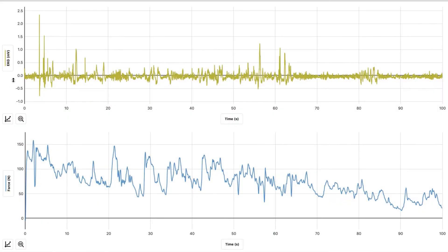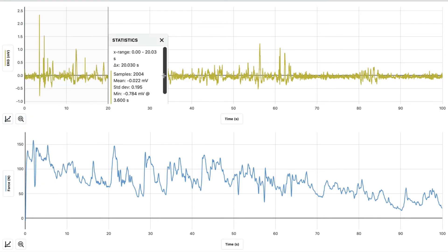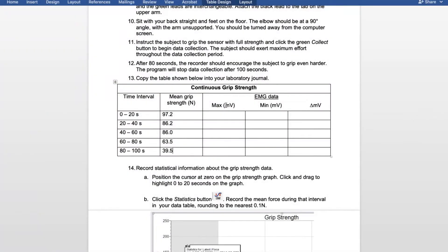Now we're going to take a look at the EMG in millivolts. Select and highlight from 0 to 20 seconds. Hit the graph, view statistics, and look at the minimum and maximum mV values. For 0 through 20, the maximum was 2.34. We're rounding to the closest 0.01. The minimum was negative 0.78.